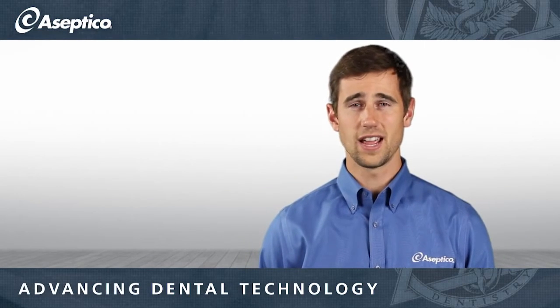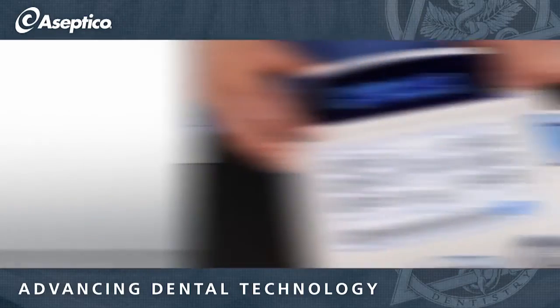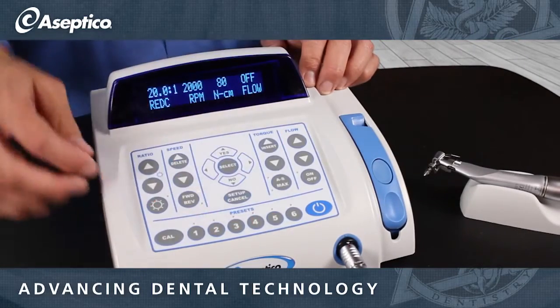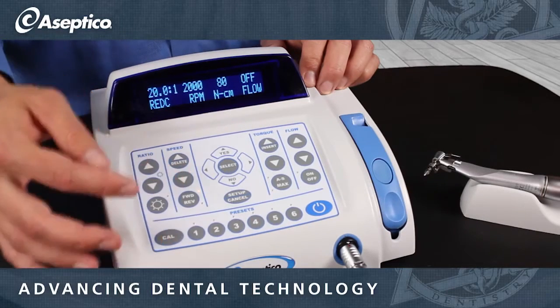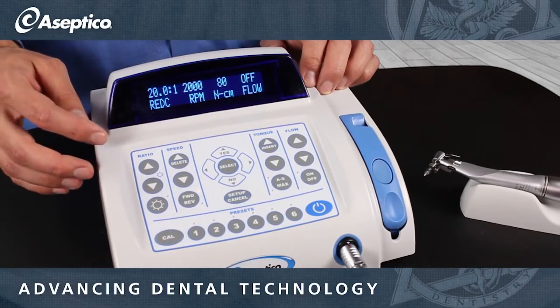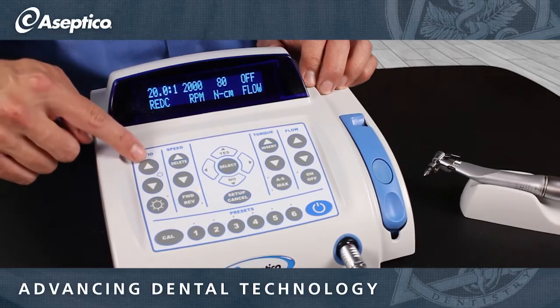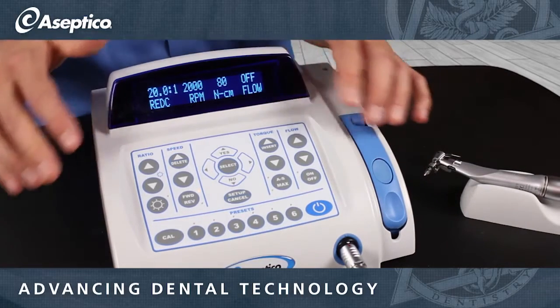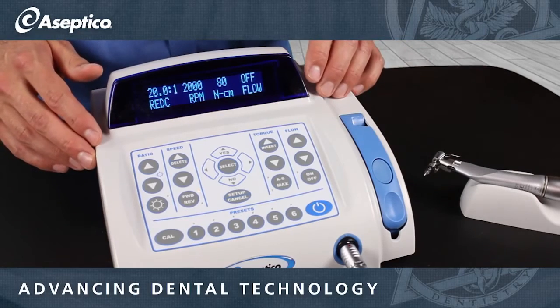After calibrating your handpieces, you'll want to move on to customizing your presets. The 7000 series has six available presets, and each one can be used individually for both implant and endo, giving you 12 possible programmable presets. In implant, you're going to be able to adjust the ratio, speed, torque, and flow at any point during your procedure, though most of the time you'll want to set those up beforehand.